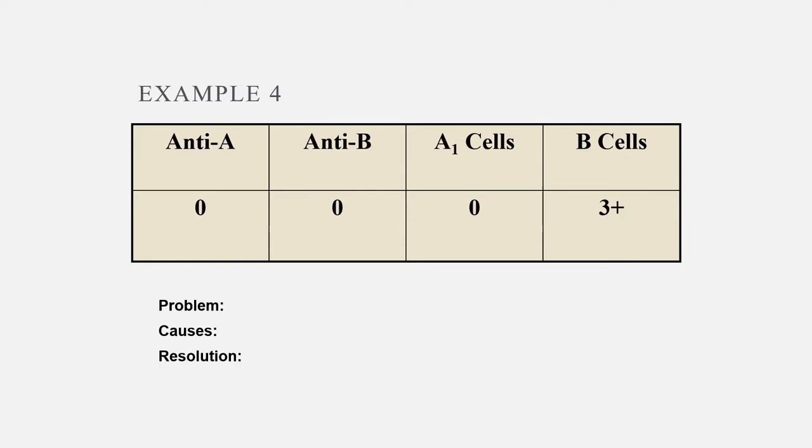They're so big, and because they have five antibodies put together, they can agglutinate on their own. They don't need the anti-IgG to cross-link. They can cross-link all by themselves. That's why you can see positive reactions at immediate spin, because your anti-A and your anti-B are IgM antibodies.